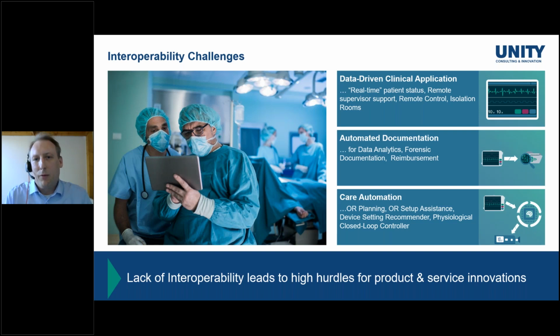On this slide, I would actually like to summarize that the lack of interoperability leads to high hurdles for product and service innovations, especially to those that are intended to make use of the data of medical devices. Some examples are data-driven clinical applications, maybe those that are real-time displays directly at the point of care, or remote supervisor systems, but also systems for automated documentation, where the data can be later used for clinical research or just for reimbursement purposes.